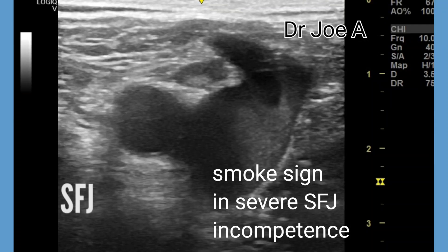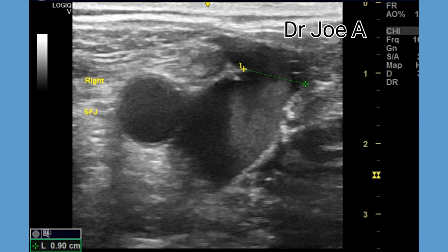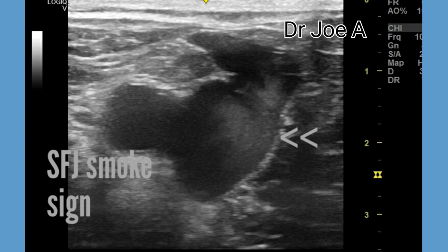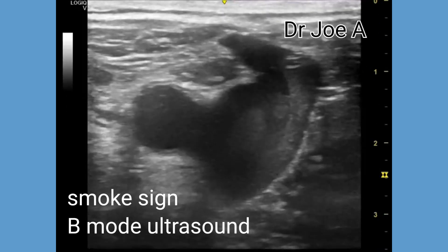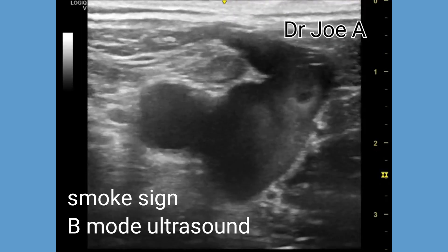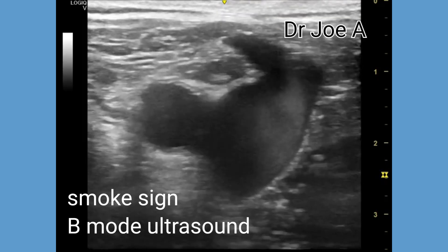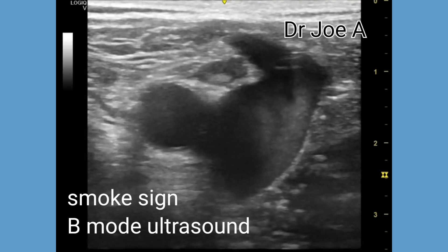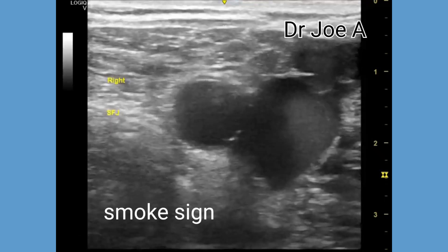This is an adult patient with severe saphenofemoral junction incompetence, giving rise to the smoke sign. The diameter of the saphenofemoral junction is almost 1 cm. The smoke sign is seen on B-mode ultrasound of the saphenofemoral junction and is a significant finding on ultrasound imaging of the veins, especially in the saphenofemoral junction. It indicates severe saphenofemoral junction incompetence and the presence of turbulent flow in the veins, which is a hallmark of venous insufficiency.